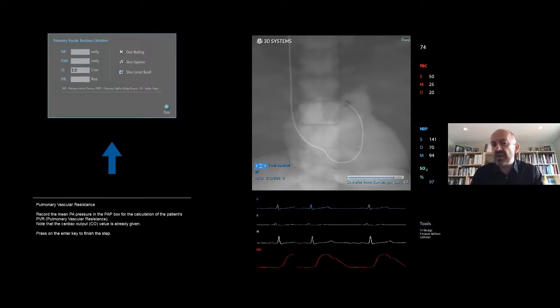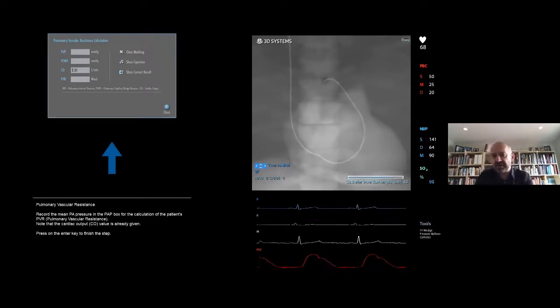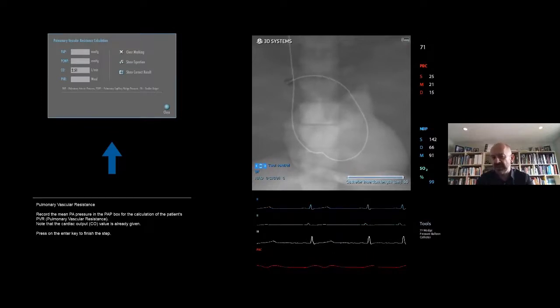The catheter will, as you see, almost always go into the right pulmonary artery. You can see how it's going to the right artery, so keep pushing, and you just keep going. You don't know where you're at because you're not seeing this, but here now, your pressure suddenly got flat. That means the balloon got wedged in the pulmonary artery and occluded the flow. So now you actually got the wedge.